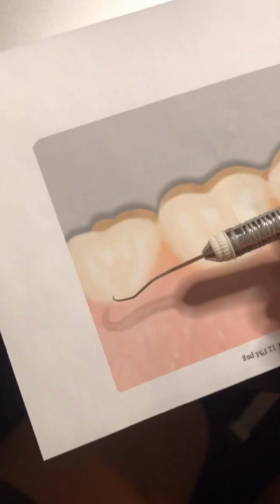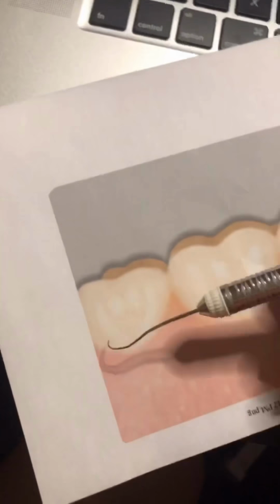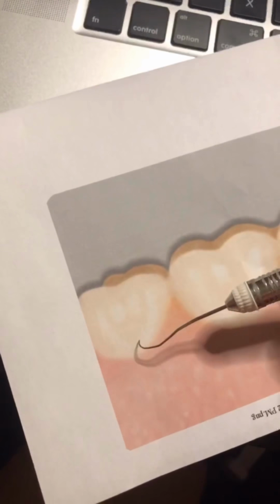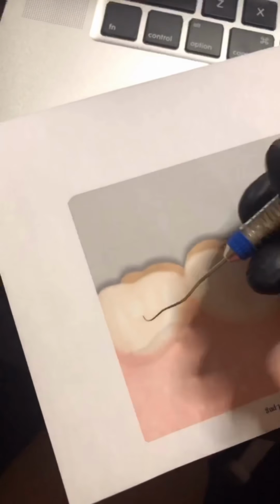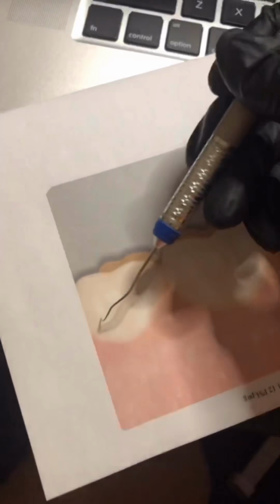Now to show you the correct working end, this would be the wrong working end because it's not standing up and over the tooth. It's going across horizontally, which we don't want. So we want to flip it and make sure that our probe is actually going up and over. So if you can see that angle of up and over.